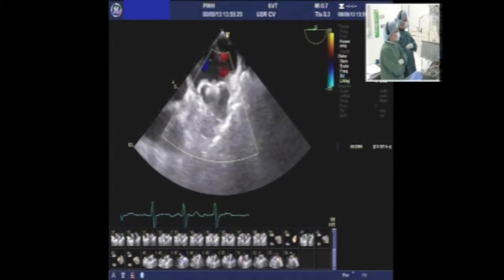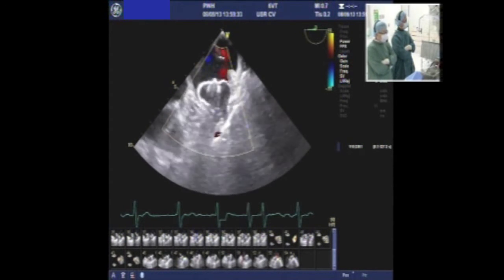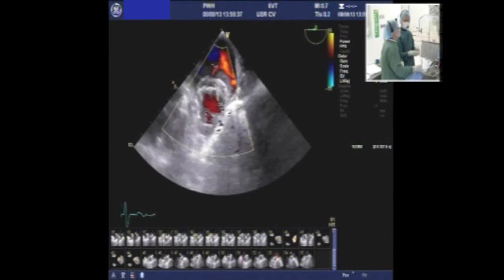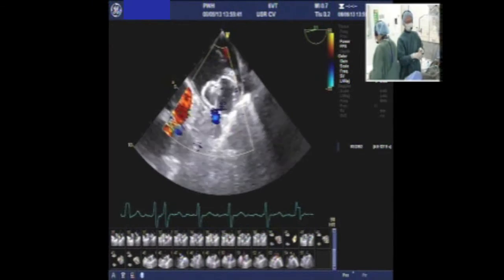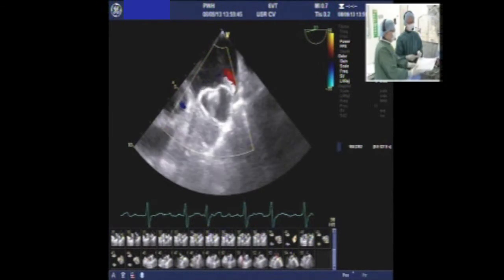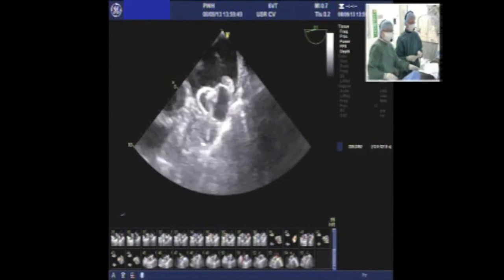Let's go through all views. Okay, this is 0 degree. Now we have a demo. Okay, let's show the demo. Thank you very much for the demo. Should we expose it? We prepared another device here because I wanted to exchange this, but we can now.